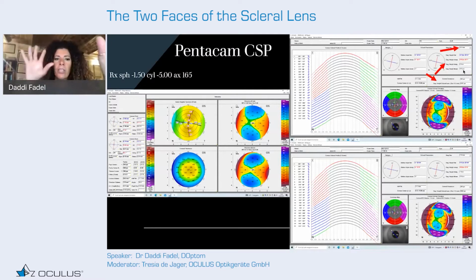If the sagittal height of the lenses in your set is calculated at 17 millimeters, the measurements of the sagittal height are obviously different in this chord, and also the lens sagittal height calculated is different. The lens sagittal height calculated by the software is incredibly important, because it allows you to reduce the number of lenses applied on the eye, save time, and avoid stress and anxiety for the patient.